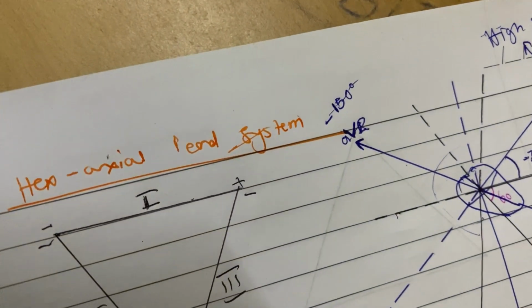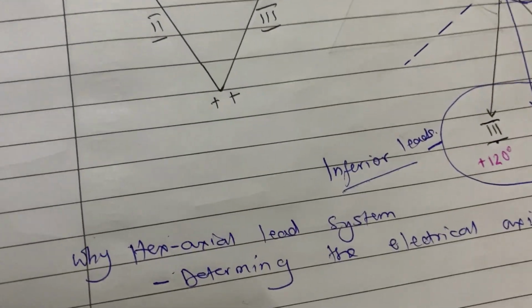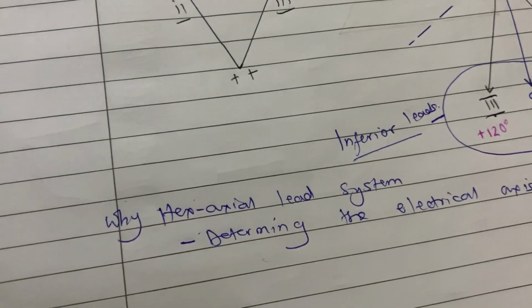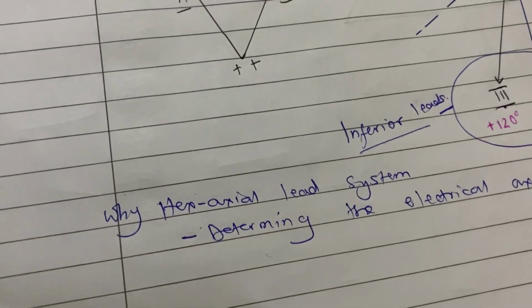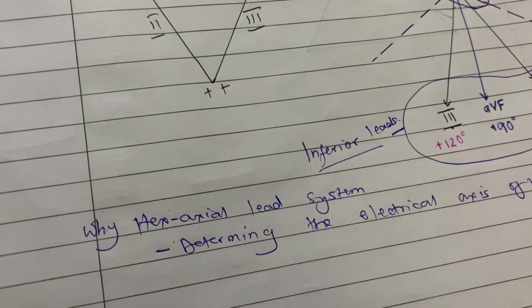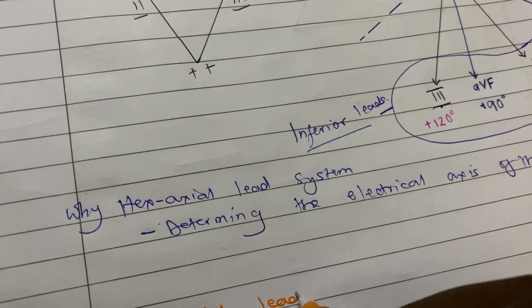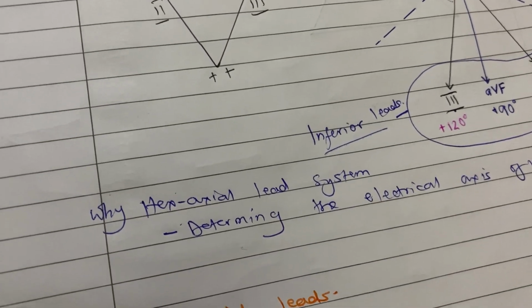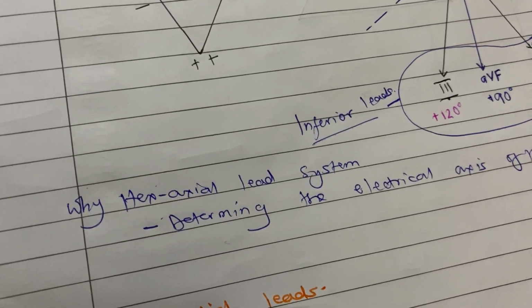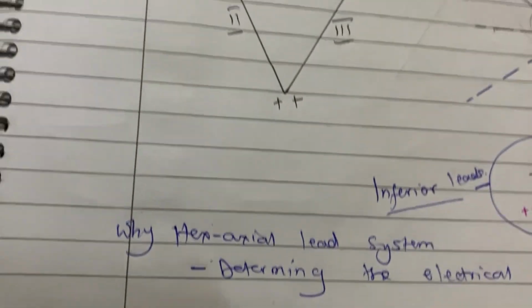So point number 2. We are going to go on to precordial leads now, chest leads. So precordial leads, what are they?